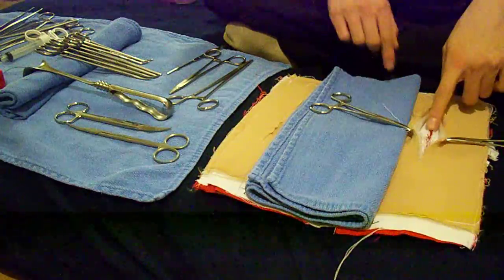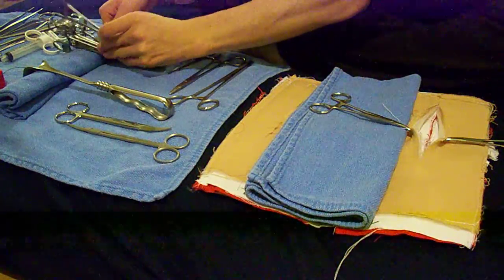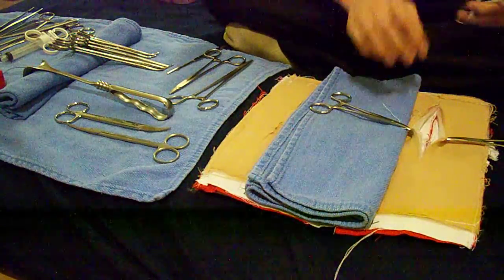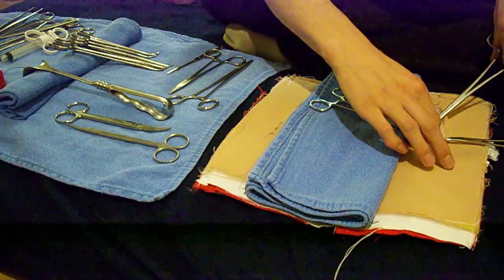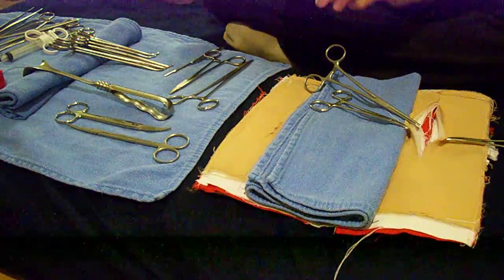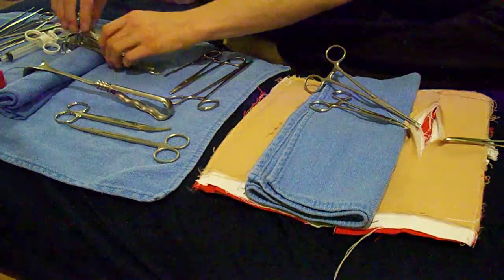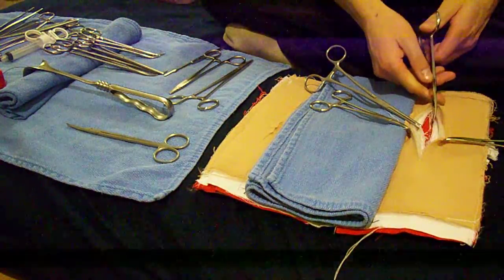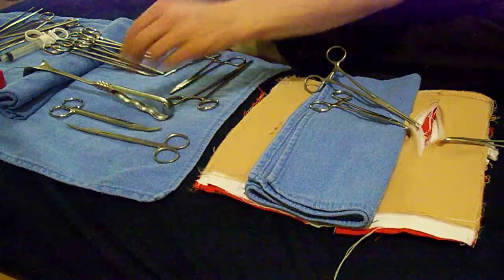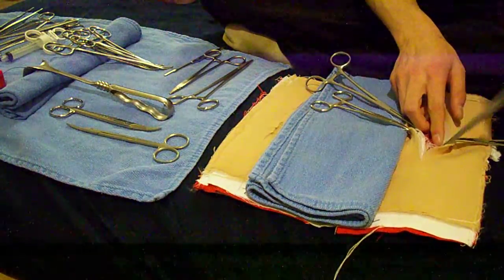Now that we've passed the skin and subcutaneous layer, we are on to the fascia, which is a tougher layer. We grab the fascia with a stronger toothed instrument called the Kocher. We would then use a new ten blade — not the one off the back table — to incise the fascia, then use a curved Mayo scissor to extend the incision of the fascia for better visualization. We could grab another Kocher on the other side of the fascia.